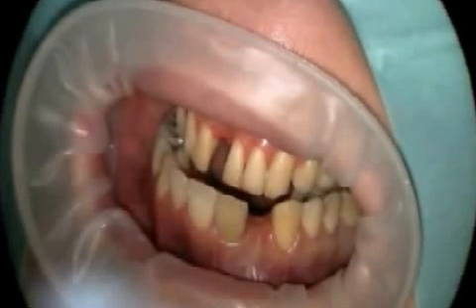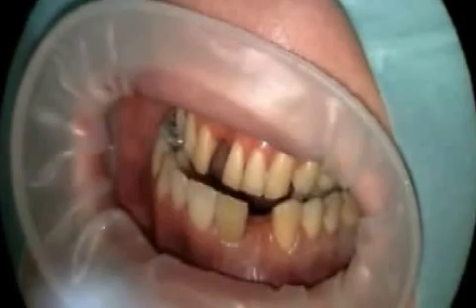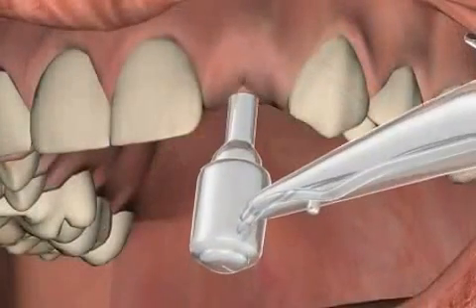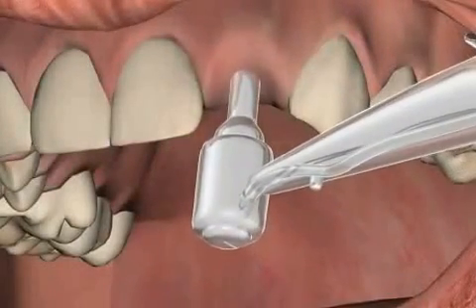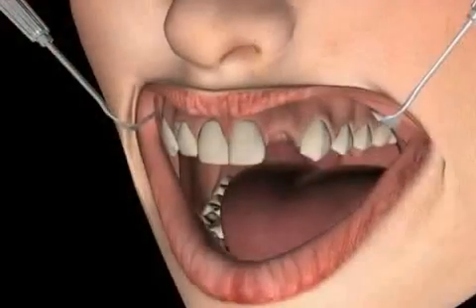In the field of dentistry, punching is a synonym for a number of minimally invasive surgical techniques. Implants can sometimes be exposed using punching techniques. You can find out more in the video entitled Exposure.